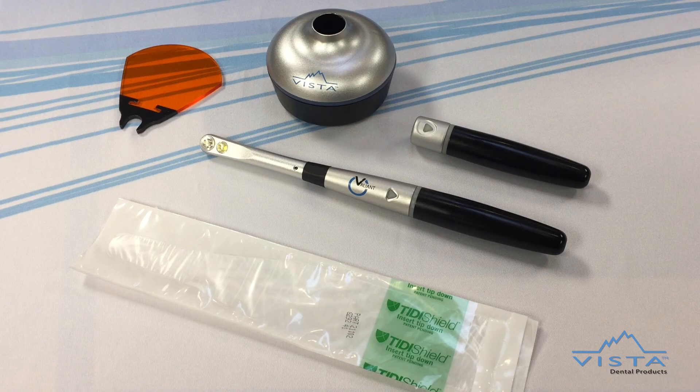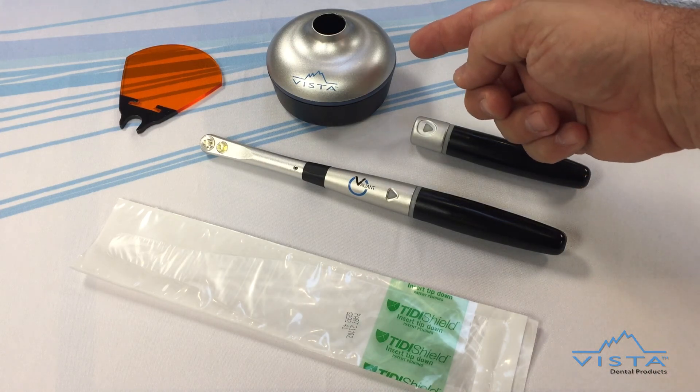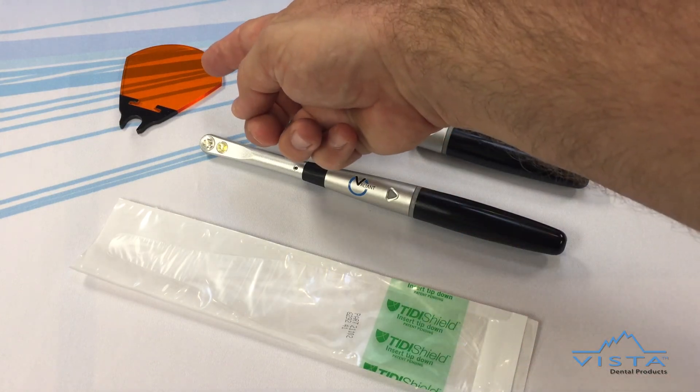The Valiant curing light starter kit comes with a handpiece, two rechargeable batteries, a charging base, 100 protective barrier sleeves, and a light attenuating shield.